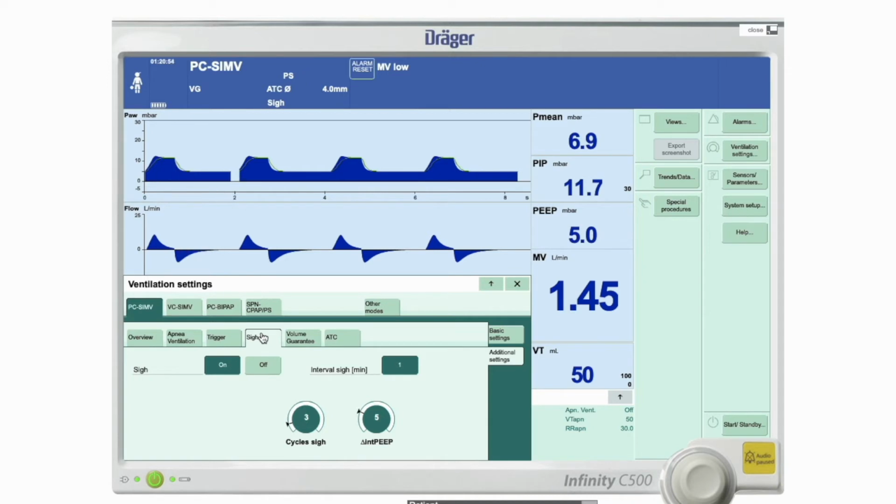It's been thought that patients who have low tidal volume ventilation, especially those with ARDS or a small white lung scenario, would benefit from sigh breaths. There's quite a body of evidence developing that's saying we should use sigh breaths in these patients. Also, patients that are self-ventilating for quite a long time on something like CPAP ASB are at risk of peripheral alveoli collapsing, and as such would benefit from an increased breath.